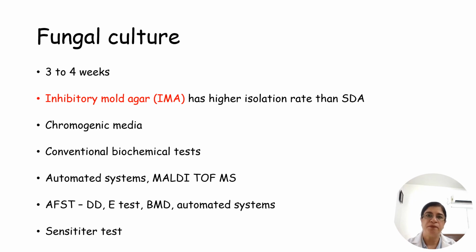Fungal culture and sensitivity testing is important to generate epidemiological data, because it is found that the species and sensitivity vary geographically from region to region depending on the use of agriculture, use of azoles. So fungal culture will take a lot of time for slow growing fungi. It can take up to 3 to 4 weeks. It is important to know that.